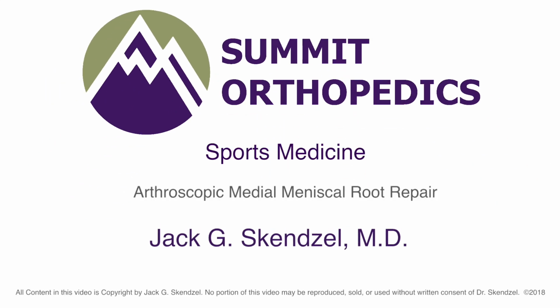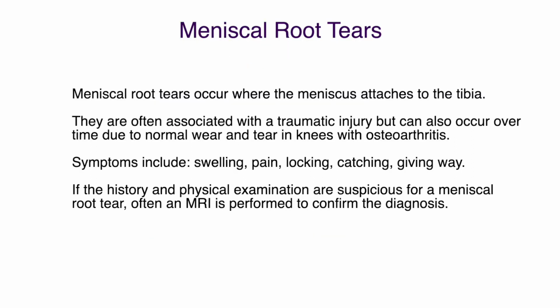This video is for patients who want to learn more about meniscal root tears, including an arthroscopic demonstration of surgical repair. Meniscal root tears occur where the meniscus attaches to the tibia bone. These injuries are often associated with trauma, but they can occur over time due to normal wear and tear on the knee, especially in those patients with osteoarthritis.